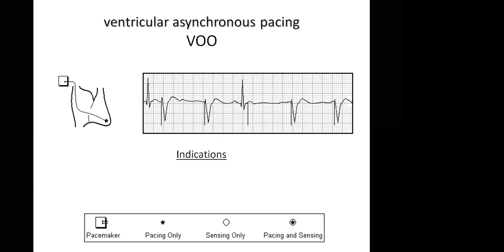Because looking at the first QRS complex, we can't see it very well, but it seems as if it's an intrinsic one, then followed by the paced ventricle. Then after it, we can see a T wave, then another P wave, and it's not being closely followed by another QRS contraction. But we can see the QRS complexes are being paced irrespective of whether it is an intrinsic contraction. The fourth contraction, we can see a P wave preceding, then we can also see a spike. I'm not sure why that QRS complex is not showing, but we can see that the machine is still pacing it. Exactly.